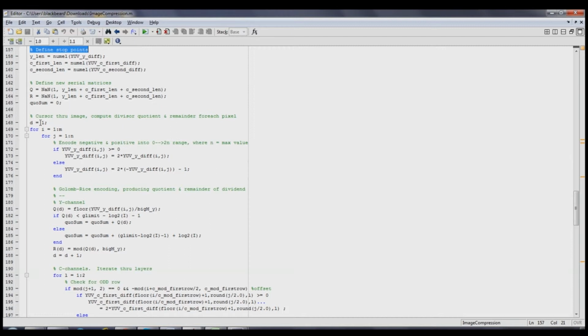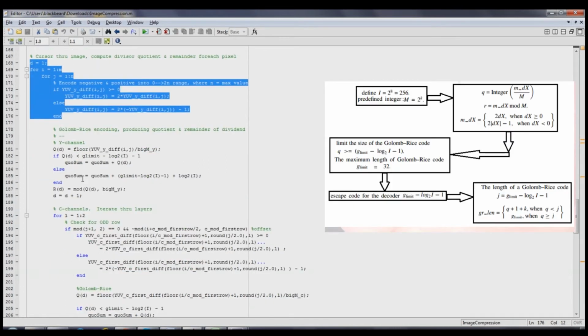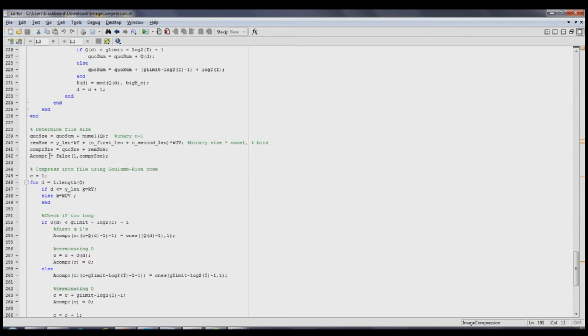So then we do the quotient, we compute that, and compute the number of bits required to encode it, add that to the allocation for file size, and then we do the remainder. So the process is repeated for the odd and even color channel rows. You can see in that for loop, it's exactly the same, just for the different channels. The next part is performance evaluation.